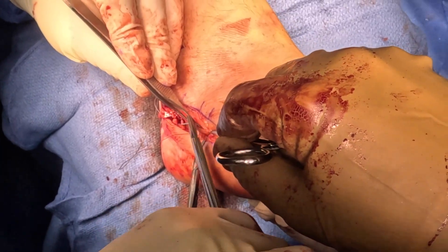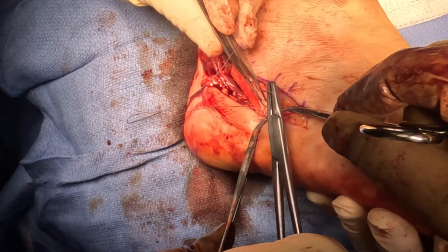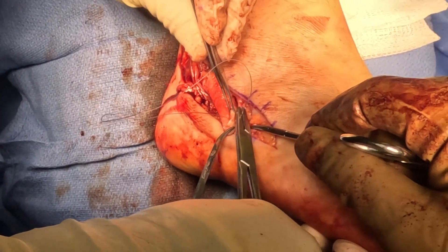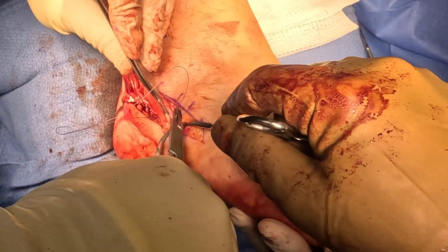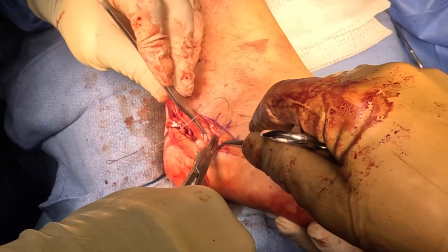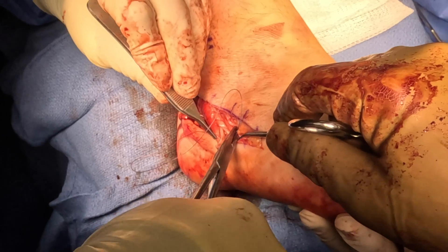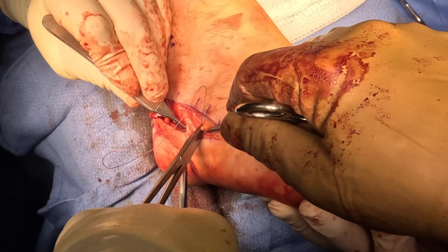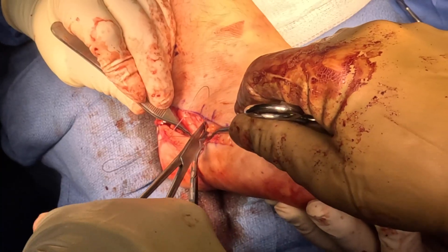So that's what we're doing here — after our anastomosis has been performed, we are wrapping the arthroflex around the tendon using some 3-0 FiberWire, which is a non-absorbable strong suture, to repair that tendon. That is it — this patient is back to normal. Hope you enjoyed this video. If you have any questions, please drop them in the comment section below.